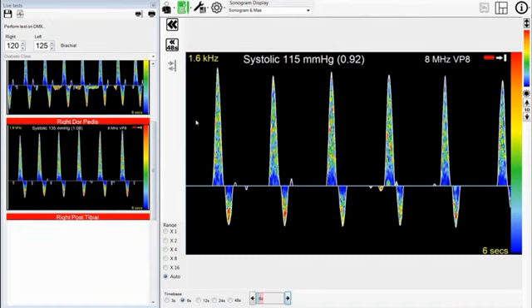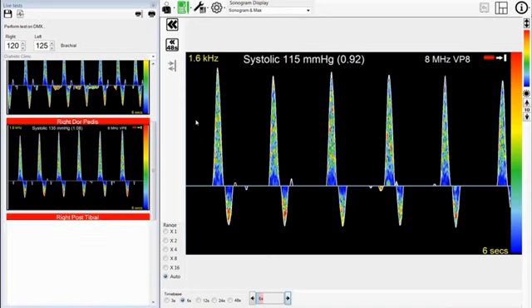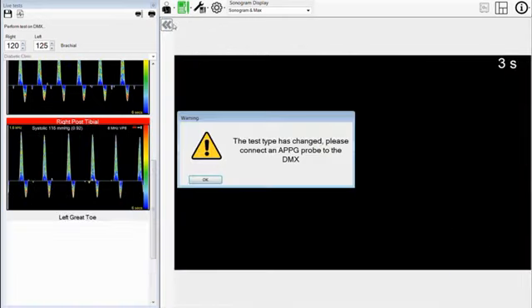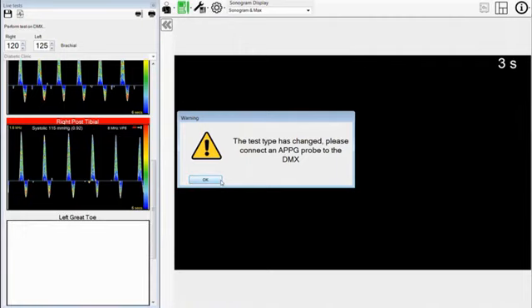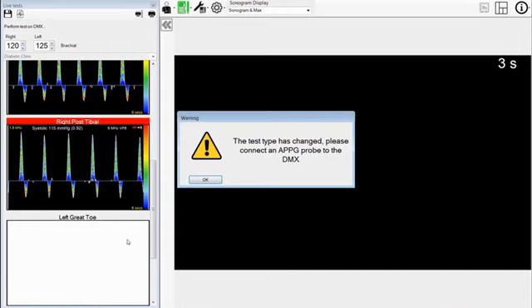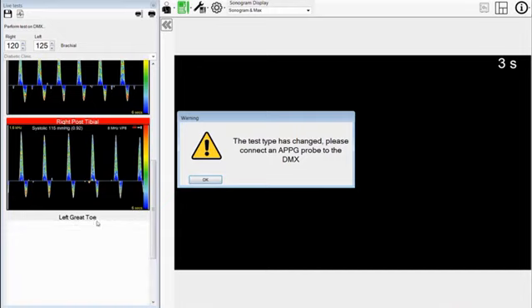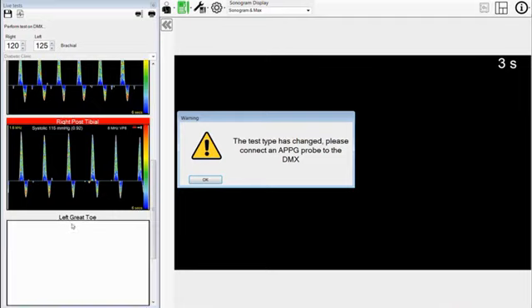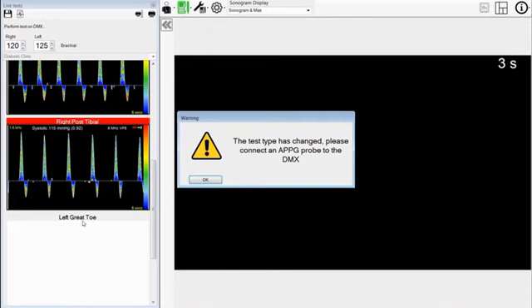The Enter key also mimics the acceptance key and will move the data across. This key will also copy the on-screen trace to the profile. Now we have come to the test type change because we are undertaking a mixed profile. You are now prompted to change the Doppler probe to the PPG probe to allow us to record toe pressures.